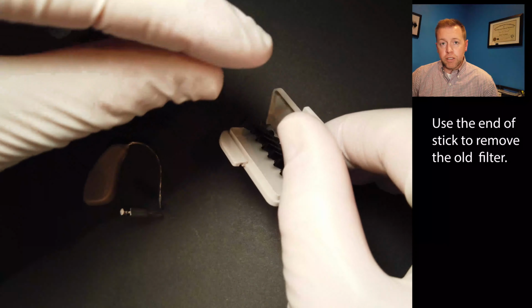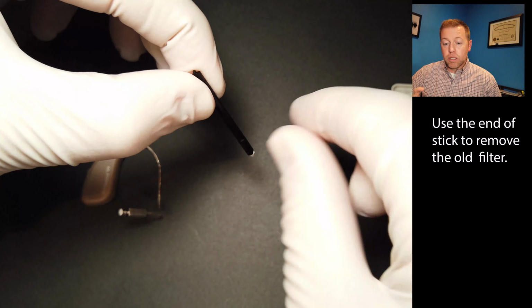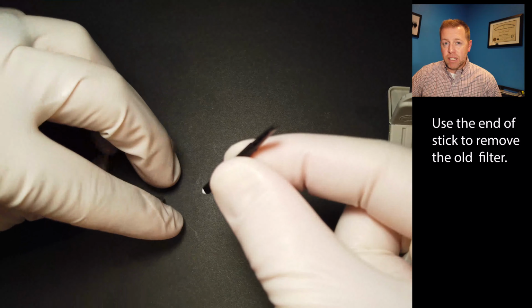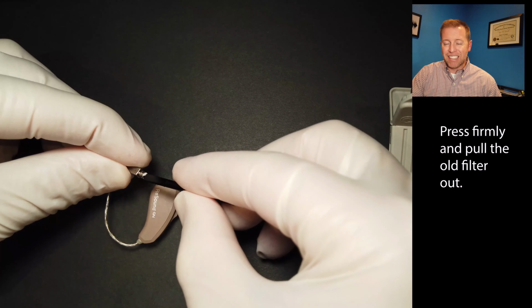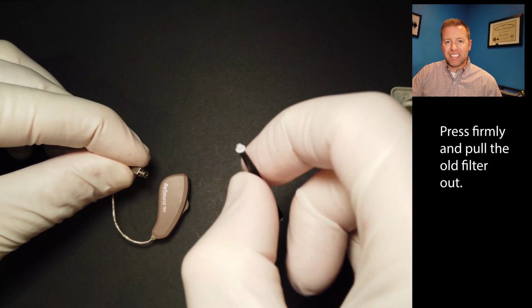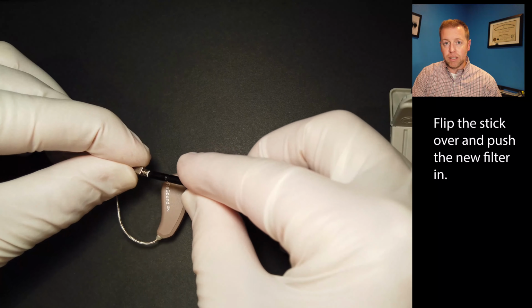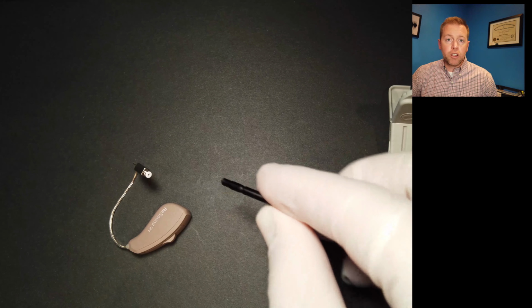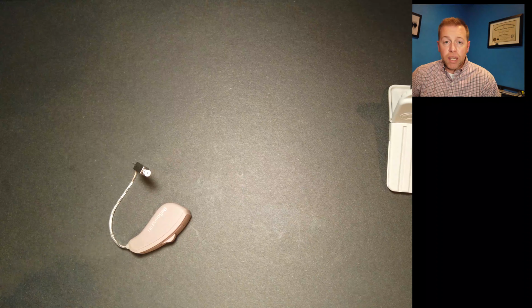Okay, so for the filter, we're going to take a stick out of the wax filter package. There's a new filter on one end, the little white piece, and then the empty end is what you will stick into the receiver of the hearing aid. That takes the old wax filter out, and then you'll flip that stick over and you'll put the new filter in. Just press firmly, pull the stick out, and you've got a new wax filter. That should fix the problem in most cases.